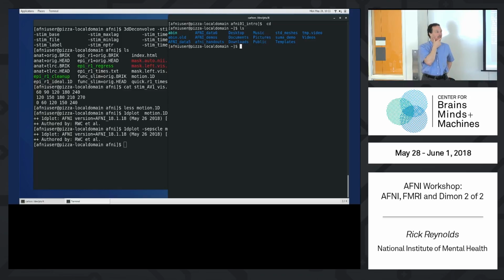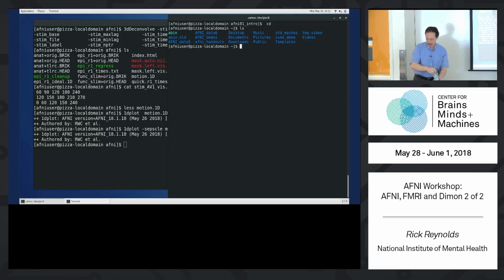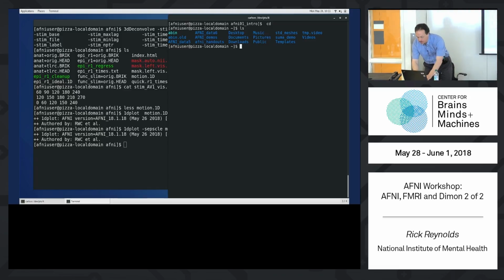So the way we have it set up at NIH for our monkey scanner, which is a Bruker scanner, is we've automated this with Dimon, using the ParaVision software to start a script that starts the Dimon software and automatically reads the data in. It's a pain for every one of the researchers to figure out exactly the parameters, and Rick's and my time was getting filled up with every variation of every experiment, and they actually write DICOM properly.